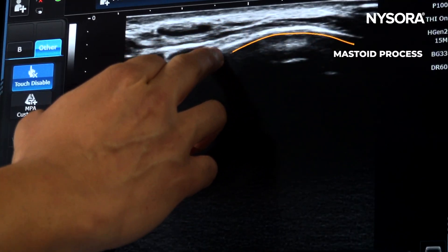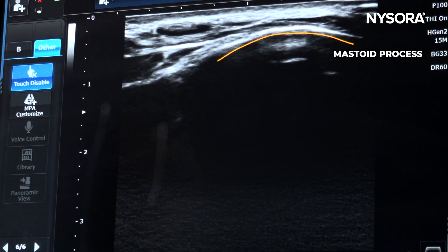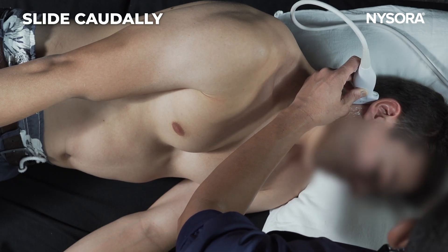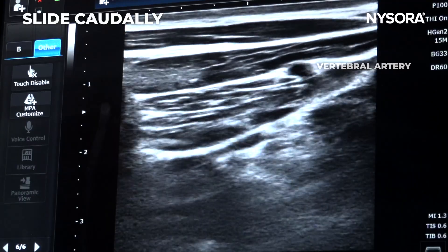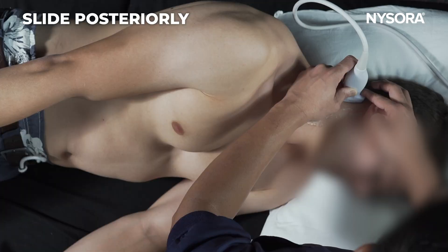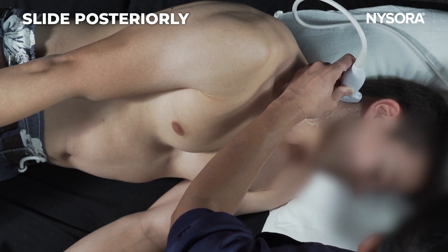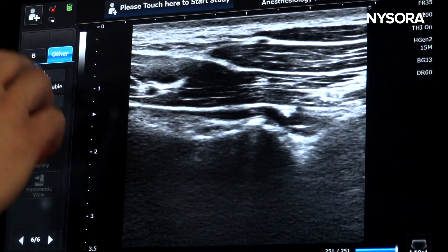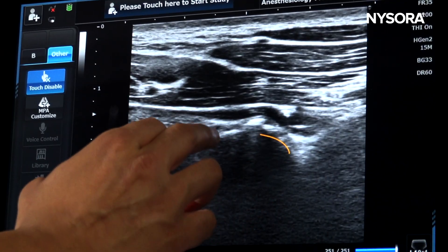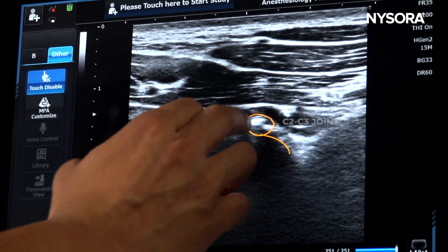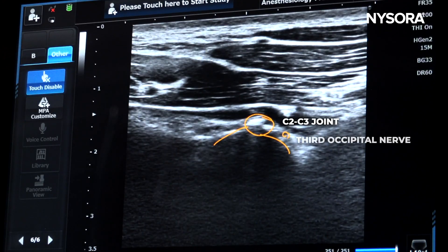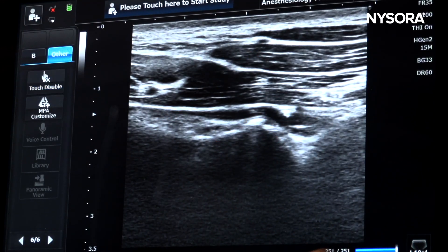The mastoid being a bone will not allow the ultrasound beam to pass through, so that's how you identify the mastoid process on the image. From there, come down and look for the vertebral artery, shown on the image. Move about half a centimeter backwards and you'll start to see the first joint in view — the C2-C3 joint. A small bright hyperechoic structure you see there is the third occipital nerve, allowing you to perform a third occipital nerve block in that area.